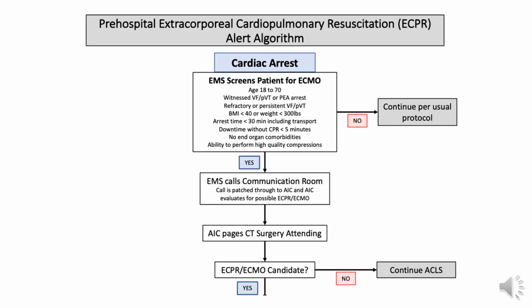This is what our internal process is going to look like. So at out-of-hospital cardiac arrest, the screening that you guys do, if the answer to any of those questions is no, continue your usual protocol, transport according to your protocol. Okay? If you think the patient needs to be transported based on your current guideline, then do. Otherwise, continue to work them on scene like you're doing currently.